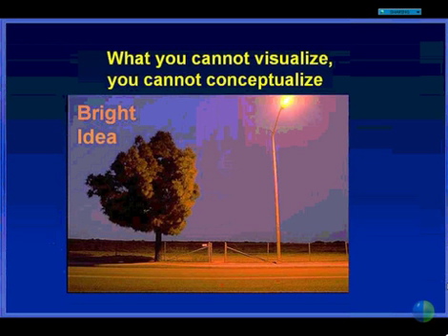All right. Another question. How do you treat when you cannot identify feeders? What I do then is I continue the anti-VEGF monotherapy with or without supplemental steroid, and then I'll re-image the patient a couple months later. Sometimes you don't image something because the photographer did not get focused in the right plane of the choroid. One of the difficulties of this technique is there's a learning curve for the photographer to focus in the right plane where you're looking for the pathology. But sometimes, for whatever reason, you can't always visualize the pathology at the initial test. But sometimes if you repeat it a month or two later, you can actually see the pathology. If I never do fully identify vascular pathology with ICG, I don't use PDT on those patients. I'm uncomfortable just randomly treating the fluorescein without having the ICG morphology as a target.